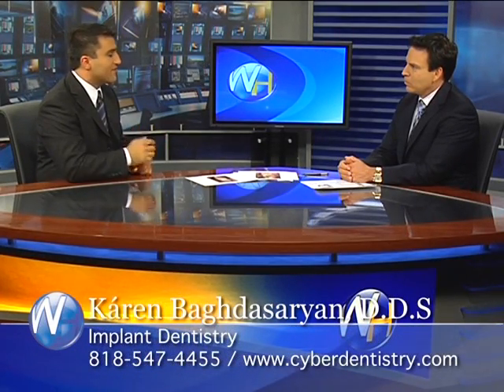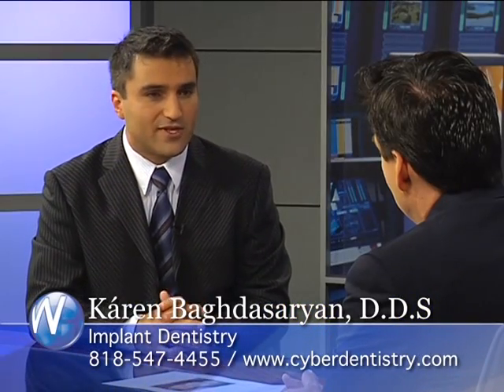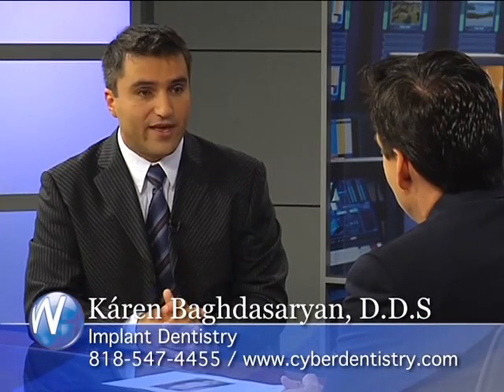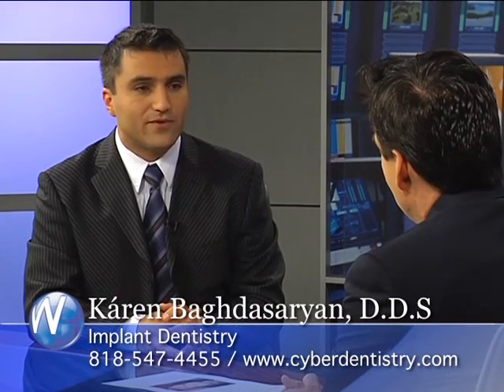I've noticed a lot of porcelain-fused-to-metal crowns create puffy gums around them, and the gums bleed sometimes, which is a negative reaction to the metal or the restoration that they have. With these restorations, the gum stays healthy. It's very important for the patient.